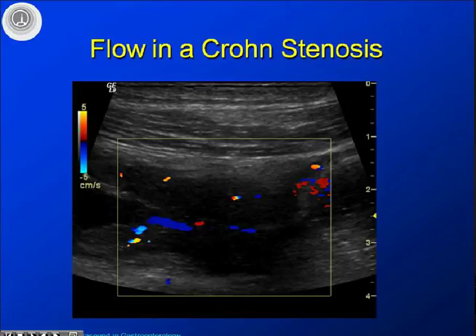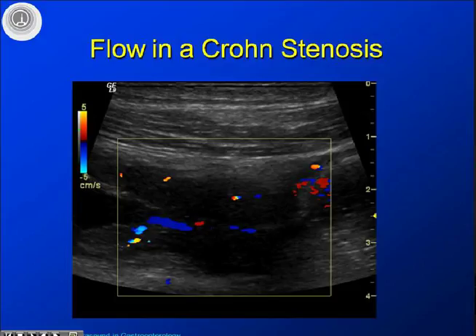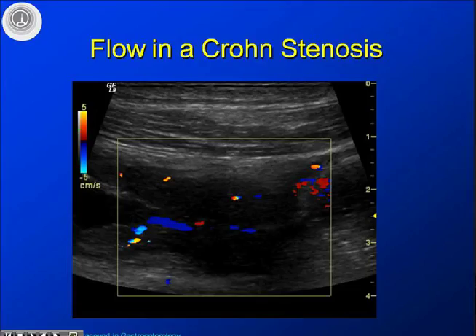This video shows how you can use Doppler to visualize a Crohn's stenosis. You can see flow within the wall, which is here very limited, and you can also use the Doppler to see how the liquid within the lumen is flowing through this stenosis — a very limited narrow lumen.